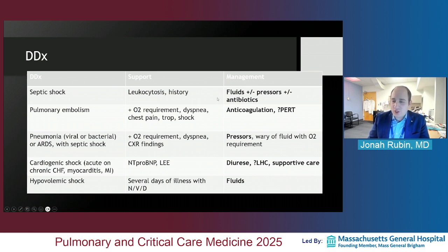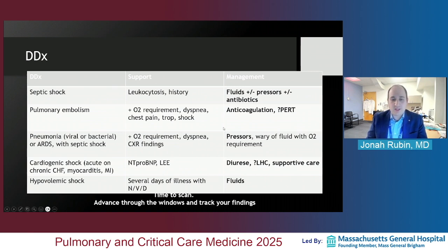So, undifferentiated shock. These patients hopefully sounded familiar. I think these patients come into our ED every day with all these conflicting data points and with different management strategies. So this is a situation where echo can really help guide your management. I should share, I don't think anyone should say that echo is the only thing you need. Of course it's not, but it can be very powerful in helping you guide your clinical assessment.